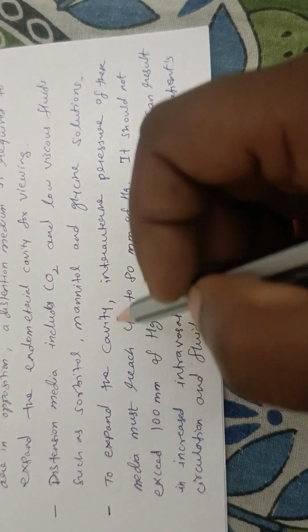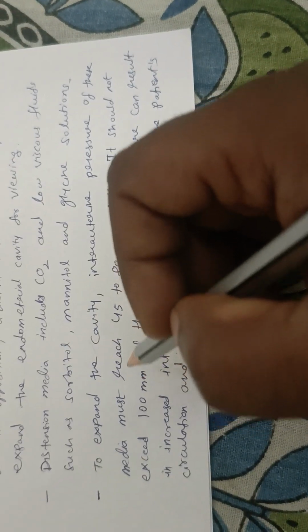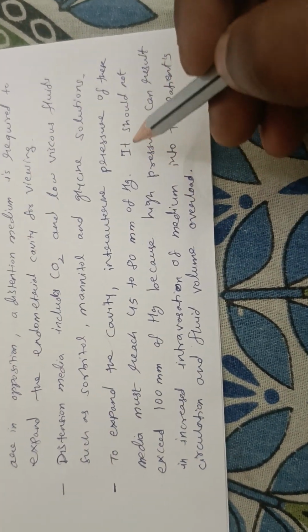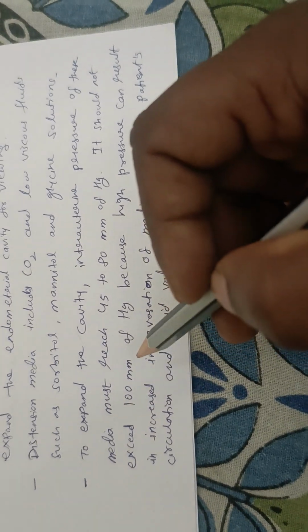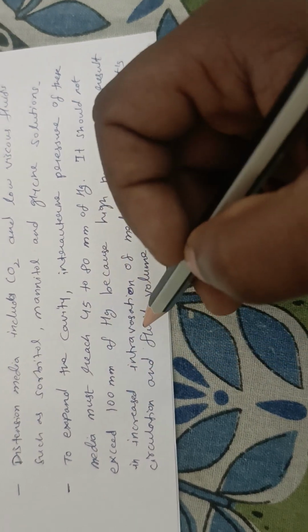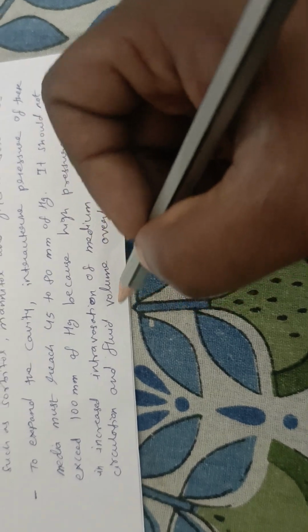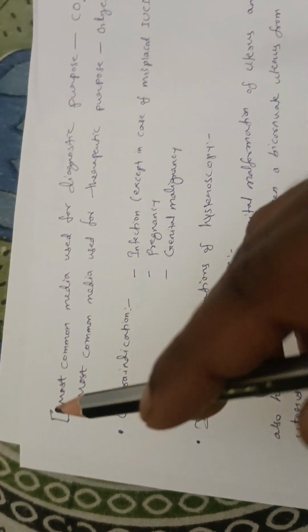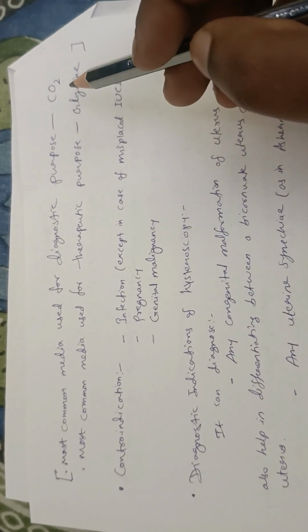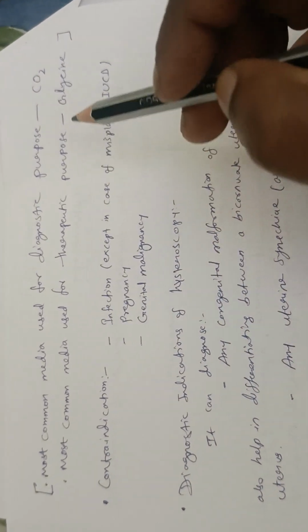To expand the cavity, intrauterine pressure of these media must reach 45 to 80 mm of mercury. It should not exceed 100 mm of mercury because high pressure can result in increased intravasation of medium into the patient's circulation and fluid volume overload. Most common media used for diagnostic purpose is carbon dioxide. Most common media used for therapeutic purpose is glycine.